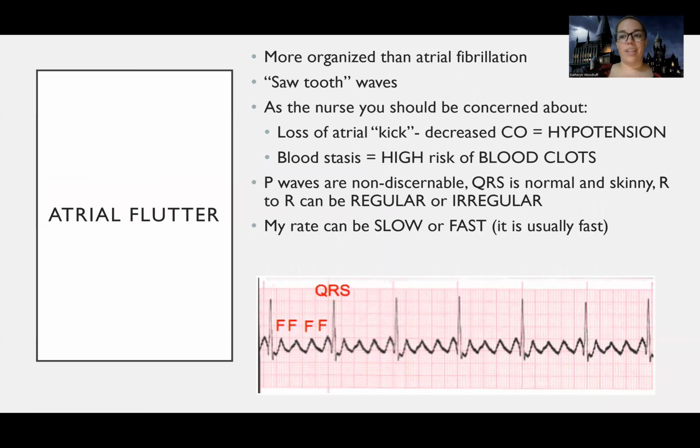So we also have a flutter. And like I said, we're not going to expect you to differentiate both, because at the end of the day, some of these are a little bit trickier. But excuse me, let me get some water. What we want to keep in mind is that this is the same thing as AFib. We treat it effectively the same. The only difference is in the waves.